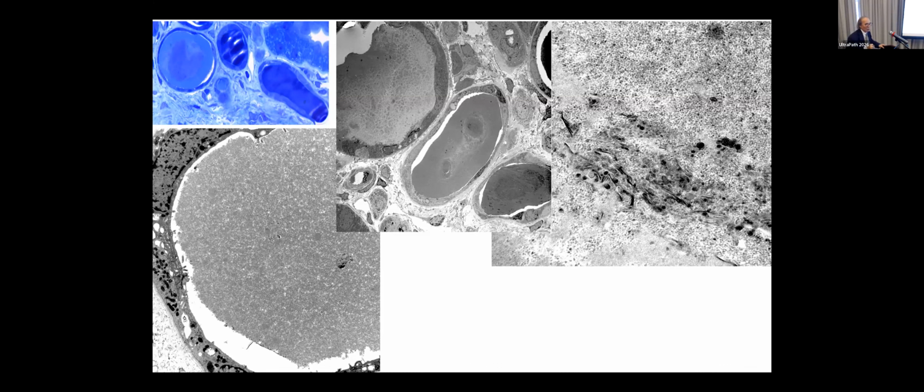In addition to that, aside from the structure consistent with uromodulin, there seems to be other structure that would probably represent cytoplasmic fragment. Now, because there are very strong immunoglobulin, IgG, IgA, and lambda kappa, we have to say that some of the structure probably represents light chain deposition and immunoglobulin deposition, and perhaps all the tiny dots that you see here may represent the deposition of light chain as well as the immunoglobulin. We come back to that pattern a bit later.